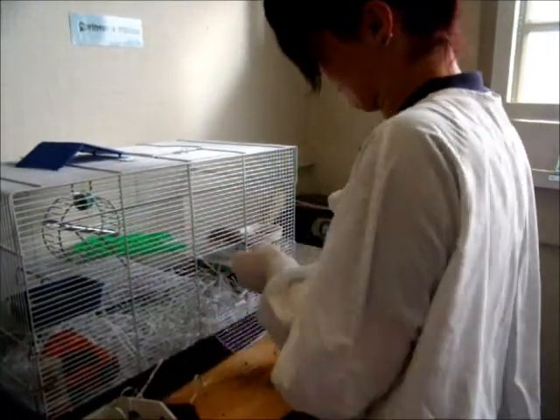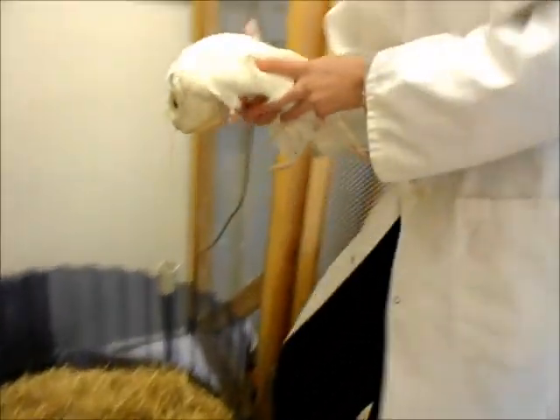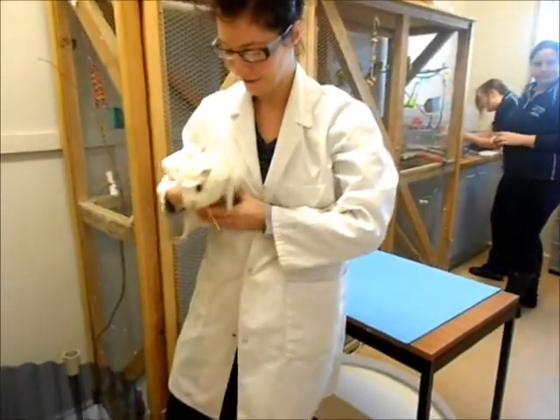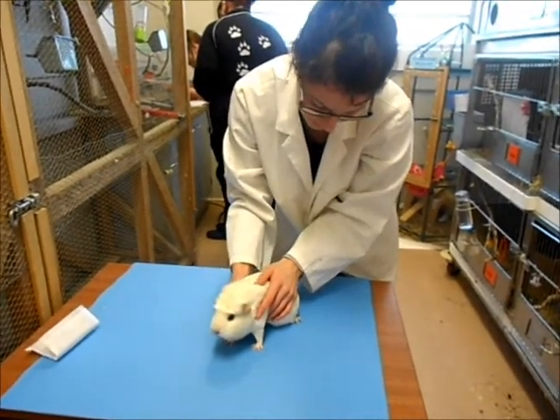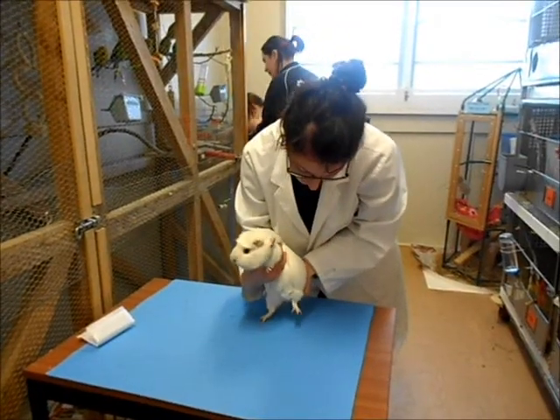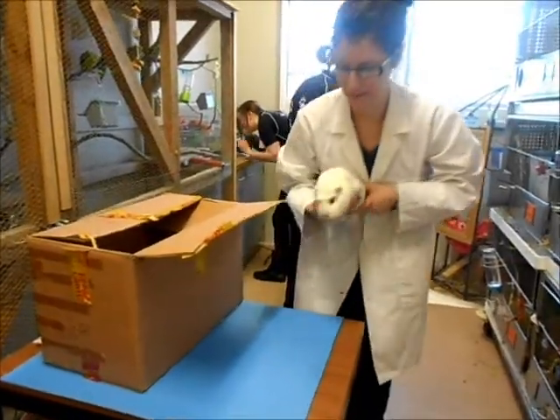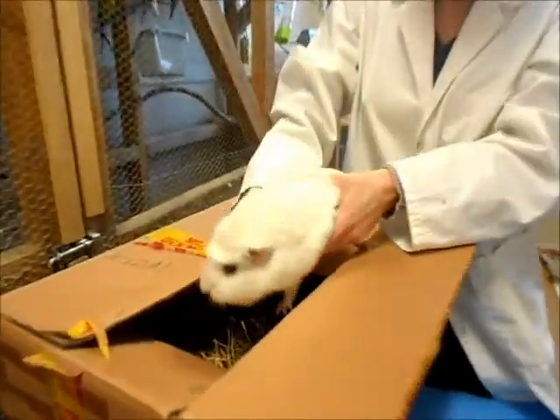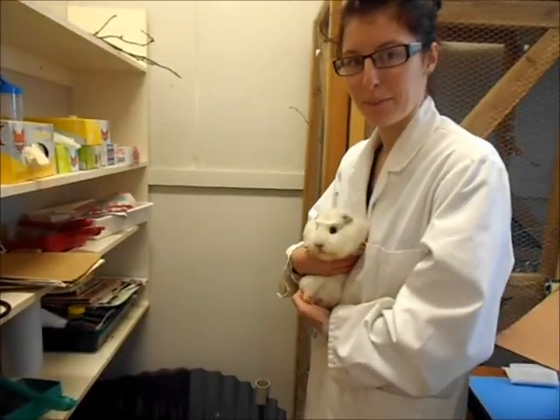This is also the cage I would use for transporting a mouse. This is how you remove a guinea pig from its cage and hold it safely. This is how you would restrain a guinea pig for general body examination. This is how I would hold a guinea pig for sexing. This is how you would put a guinea pig in a box for transport. Then put a guinea pig back in its cage.